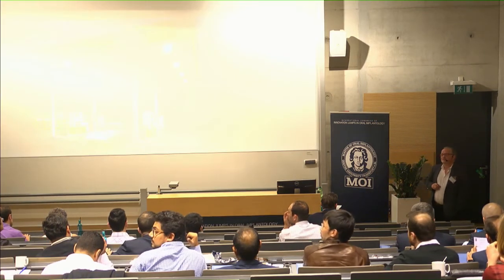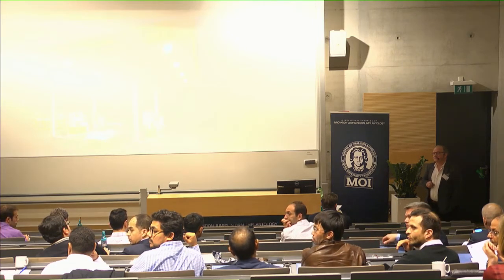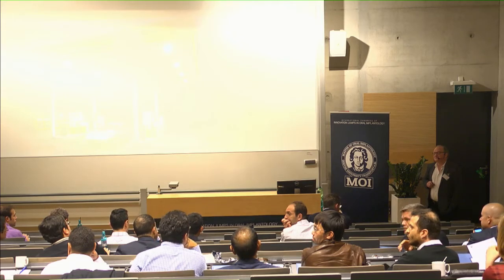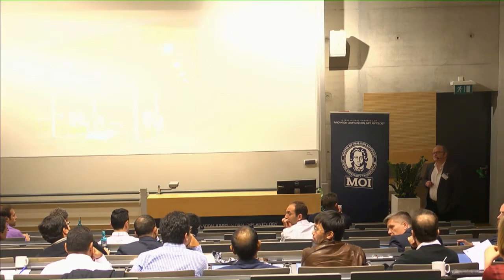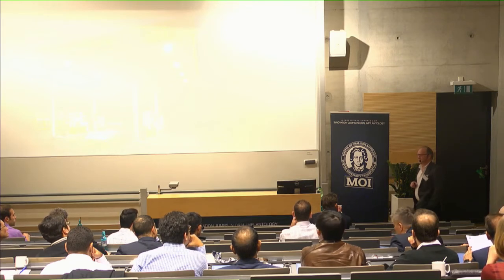And I would like to know your opinion about if you put the implants, do you set the implants a little bit subcrestal? Because the full prosthesis usually kills a little bit of bone above. I always place implants subcrestal, at least 1 millimeter. Good. Thank you very much.